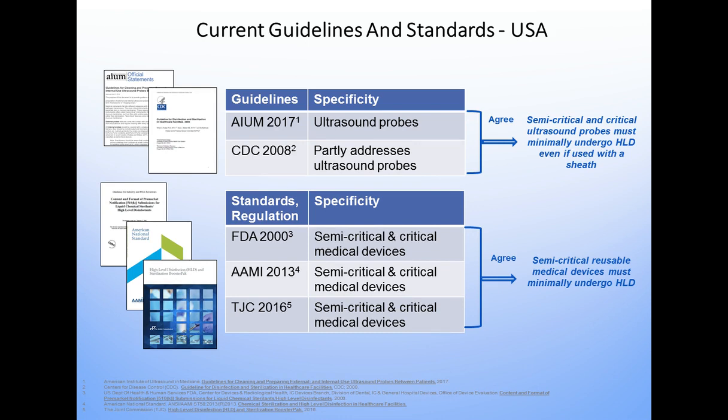So Merle mentioned some of the local guidelines in Canada and, in passing, some of the US guidelines, but I just thought I would share some of these with you. The AIUM, the American Institute for Ultrasound in Medicine, and CDC 2008 both specifically address ultrasound probes and agree that semi-critical and critical probes must minimally be high-level disinfected, and that critical probes should be preferentially sterilized. And then there are similar requirements about medical devices more broadly from the FDA, AAMI, and the Joint Commission.